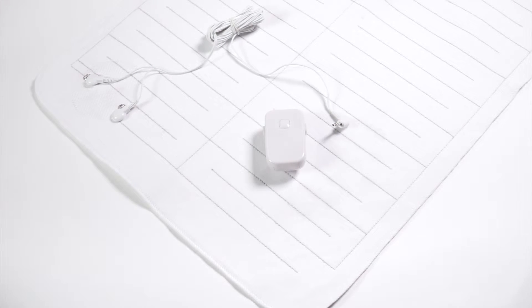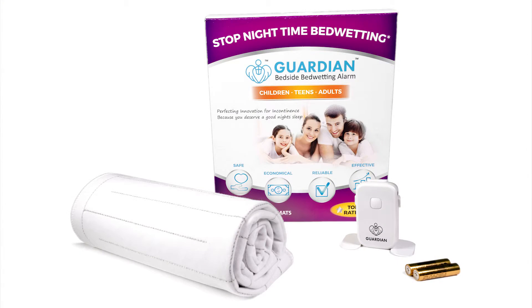To begin monitoring for bedwetting again, either flip the mat over or use a fresh dry mat. Guardian Bedwetting Alarm offers greater comfort and convenience over traditional sensors. The Guardian is available in sets of one mat or two mats for those who wet the bed frequently at night.